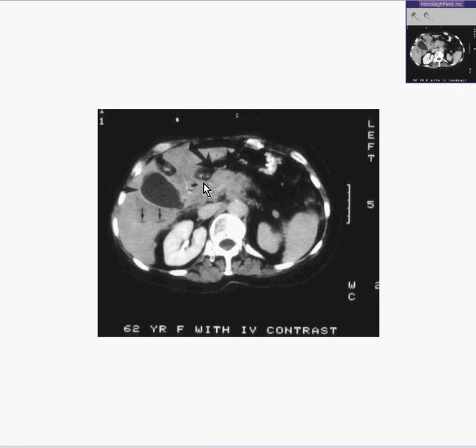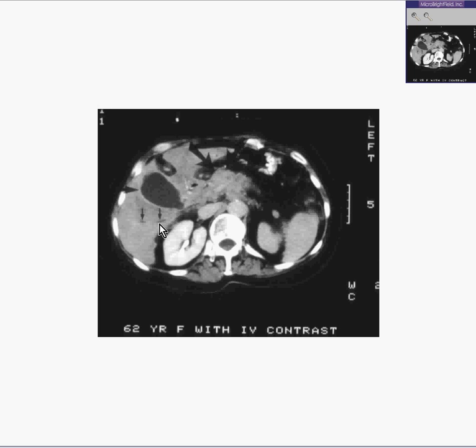Here is a CT of an abdomen. The first thing to strike you is the fact that the gallbladder is really big, like maybe it's obstructed, and that has some believability because if you look at some of the intrahepatic bile ducts, they're big enough to be seen on CT as well.